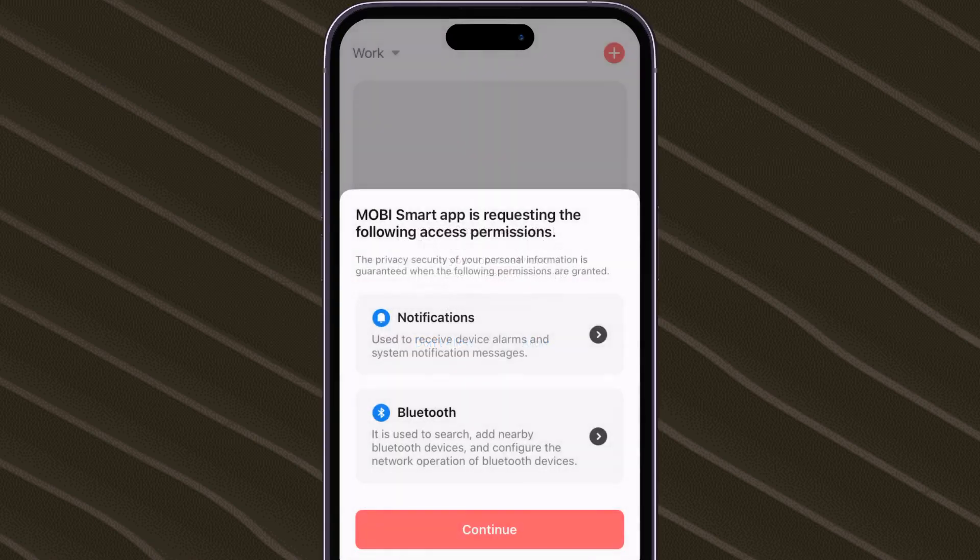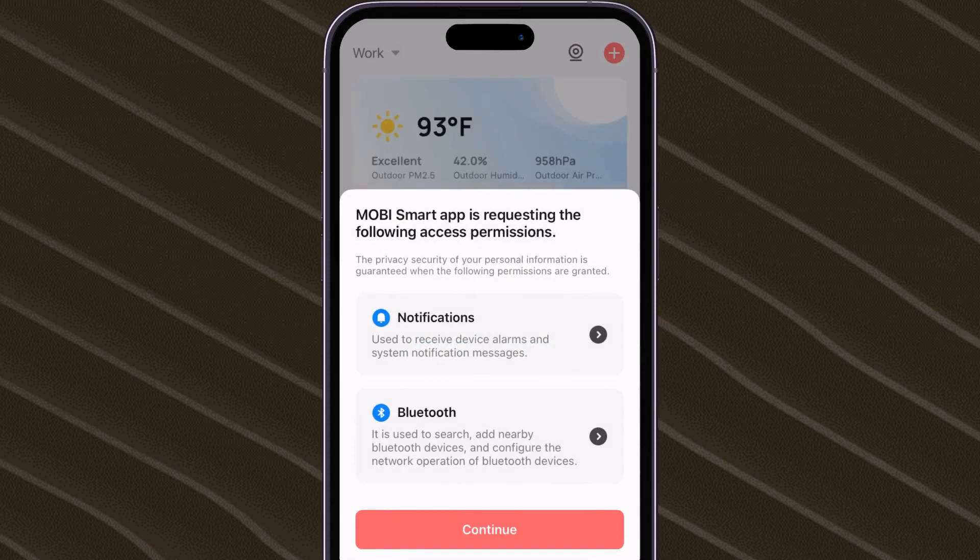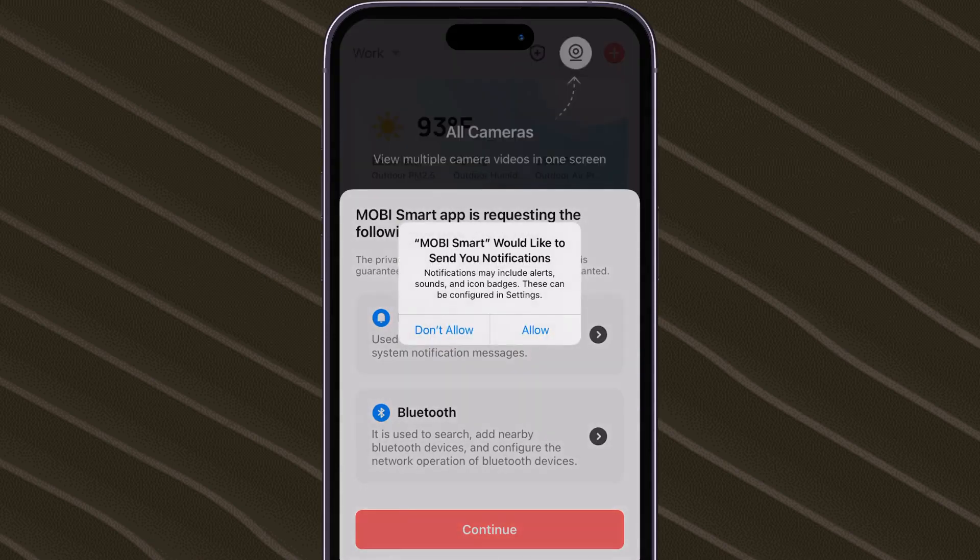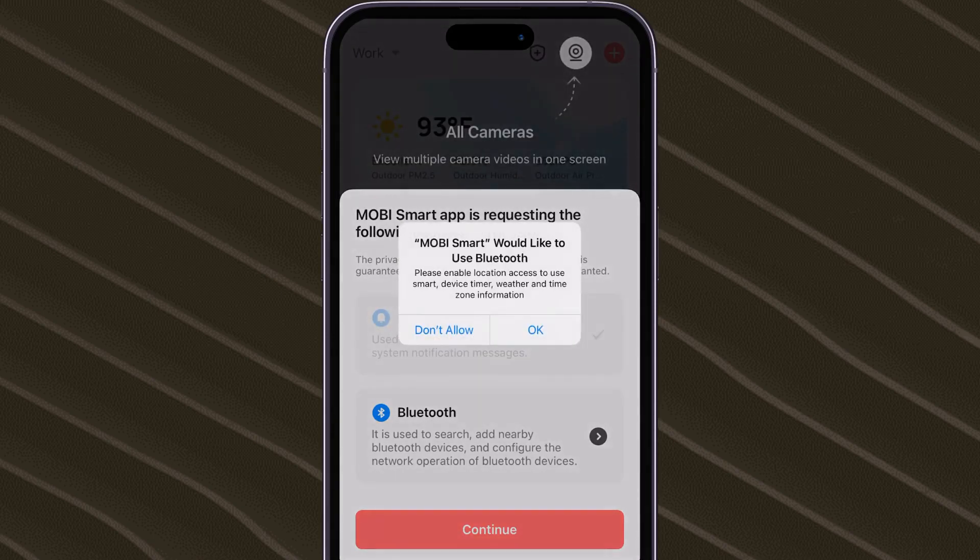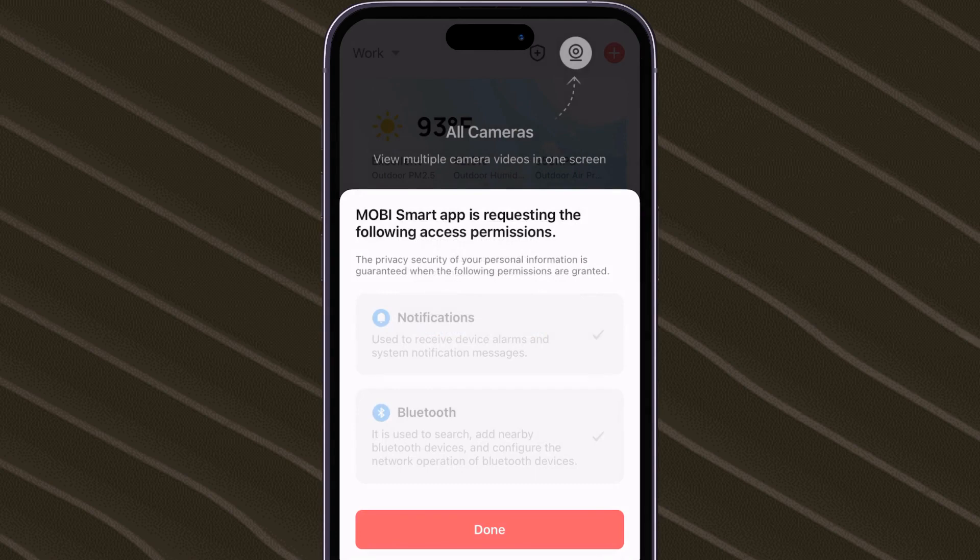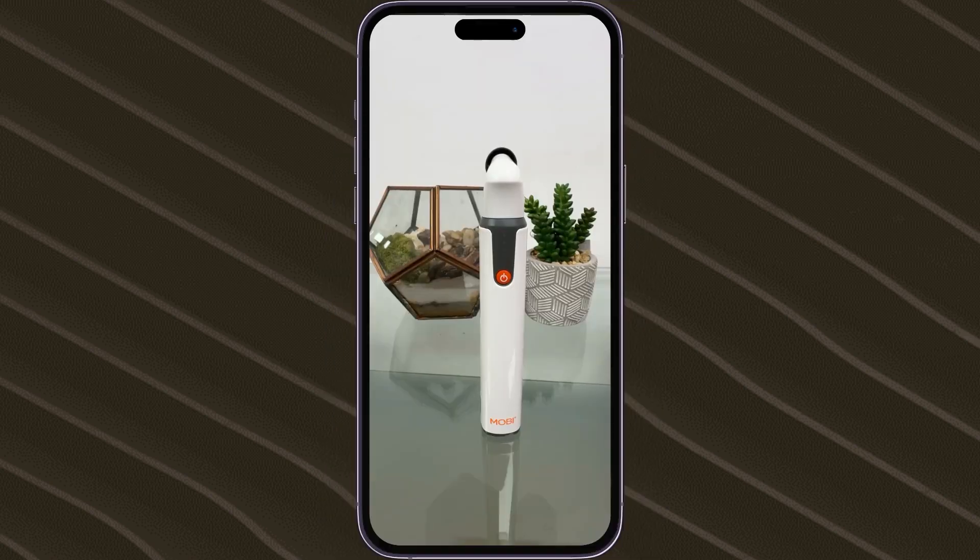Please accept or allow any pop-up messages that the app asks for, such as Bluetooth, location, and notifications. After doing so, please press and hold the Otoscope's power button until the four lights begin flashing.